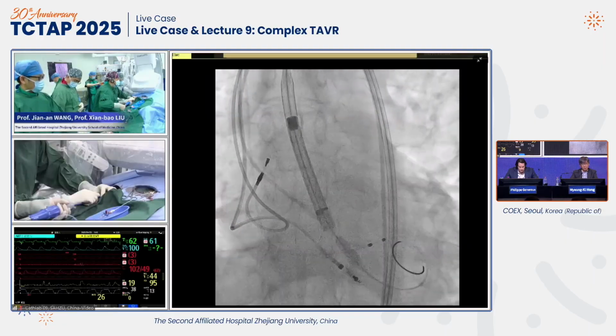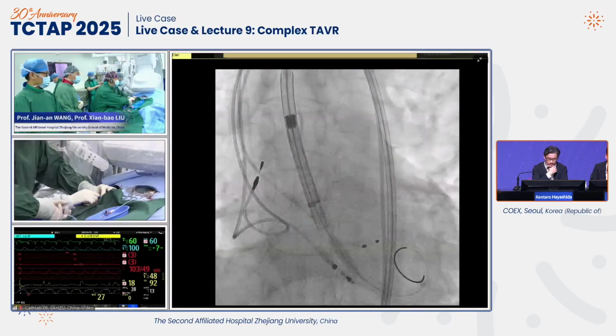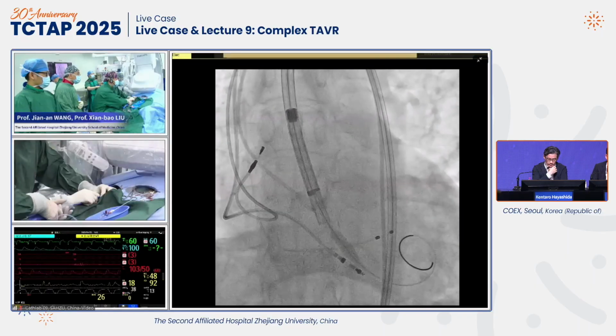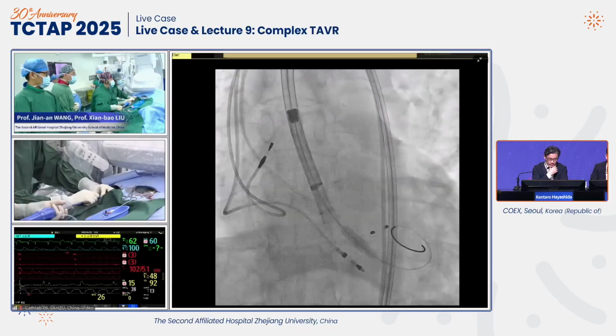Is this Pro Plus? Just a Pro, not a Plus. Pro. Okay, good. Yes, 16 French. A little bit deep. I think it's okay. We just adjust right here.